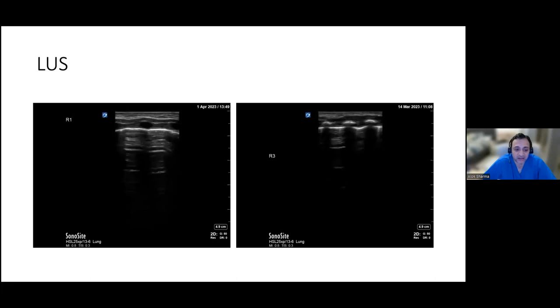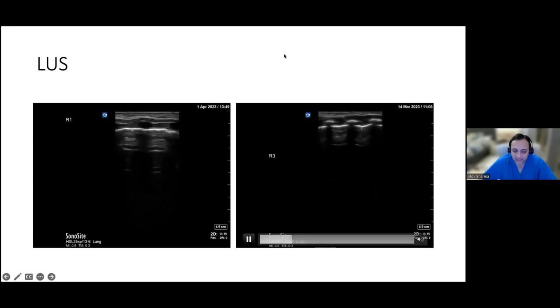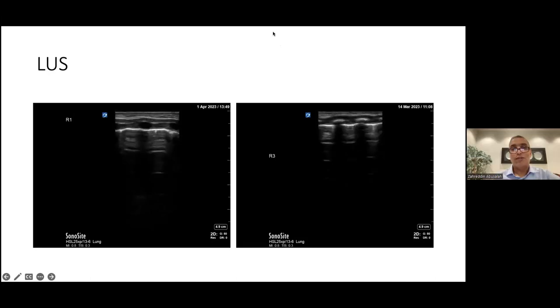And again, I think you've highlighted a very powerful way of being able to analyze the lung. We use the chest X-ray while we're learning to come back to that being our gold standard. But in terms of sensitivity and specificity, say for the diagnosis of pneumonic consolidation and atelectasis, as I will talk about today, you'll find that the ultrasound can give you a lot more information. So thank you so much for sharing this case. Dr. Hassoun, would you like to share?